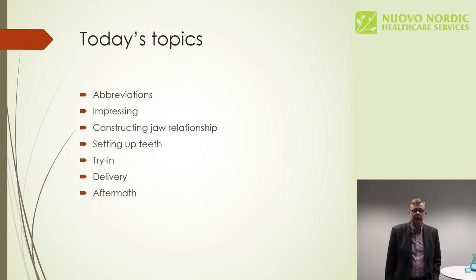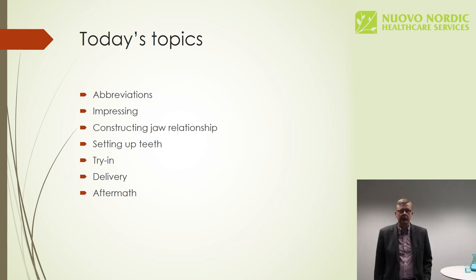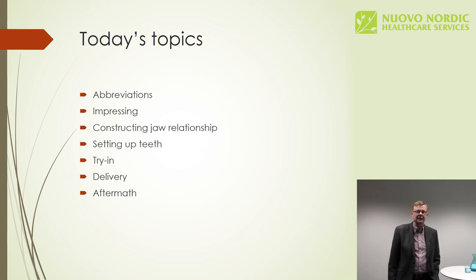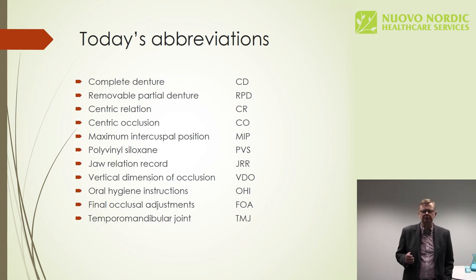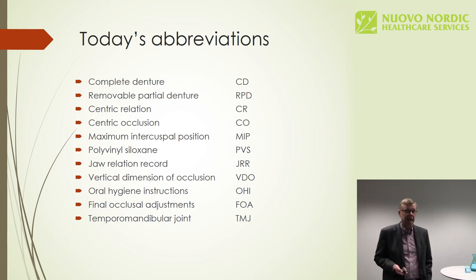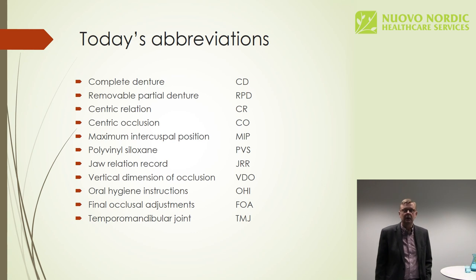As you can see, we'll go through the fabrication process. However, we are not going to do it in detail because each of these items would cover at least 1 hour's presentation. However, we have a look into each of them and we'll discuss some details, especially as simple as possible, because I have tried to make this fabrication a little bit more simple than perhaps in some other cultures where, for example, acrylic-based partial dentures are called transitional, which means they are not meant for long-term use.